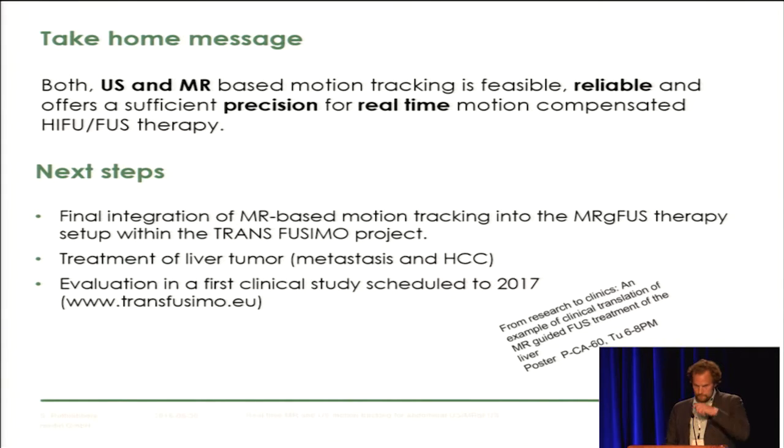So to conclude, the method is able to track features on MR images or streams of MR and ultrasound images. It is reliable and precise enough to be used in HIFU therapy devices, and it is able to do that in real time. Consequently, we integrated this tracking method within our Transfusimo treatment system, and as you heard earlier, we have a clinical study scheduled for 2017, and we are eagerly waiting for results from that study. Thank you.